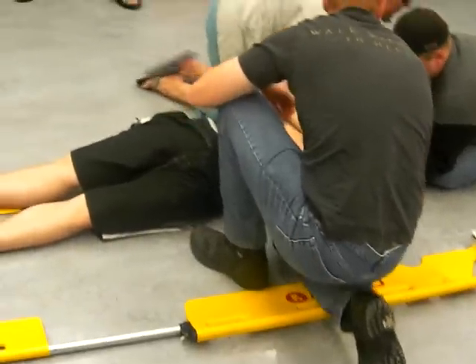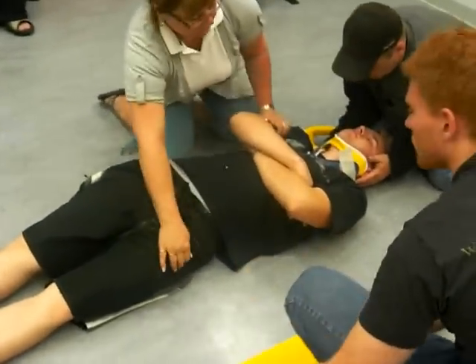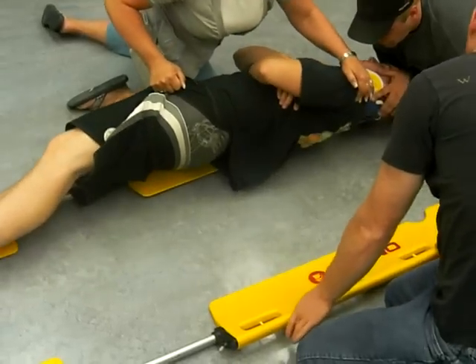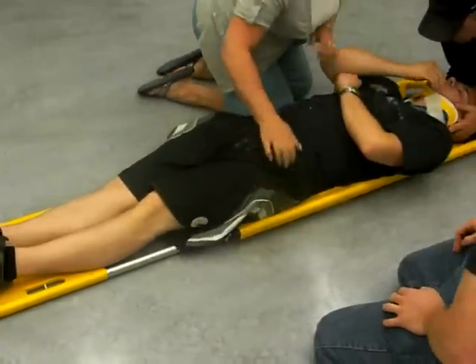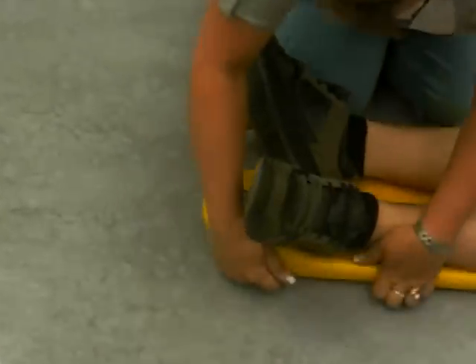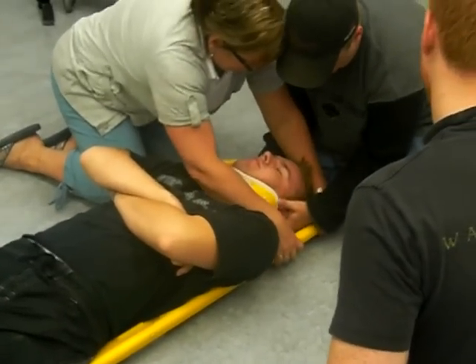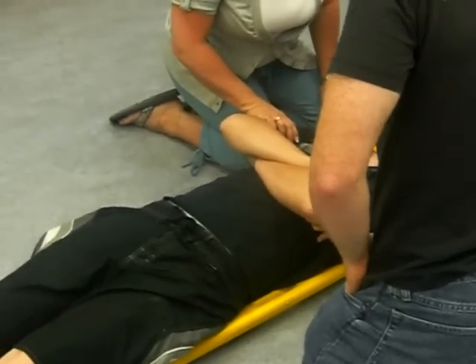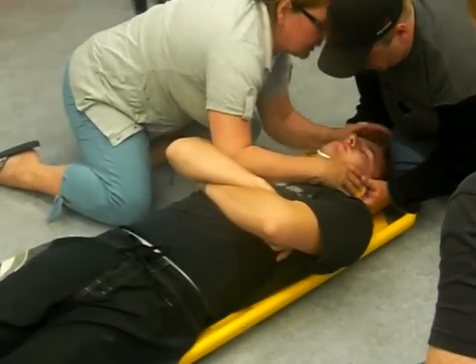I'm going to just walk my hands. Try and line up the head and the feet. To clip it in, all you do is do this. His head's really crooked there, John. His whole body's shifted — there's a vest. There's a victim right here. Can I have the headbed? Headbed.